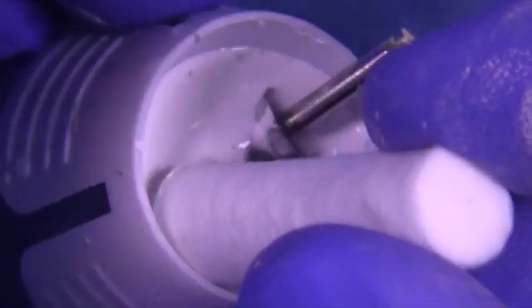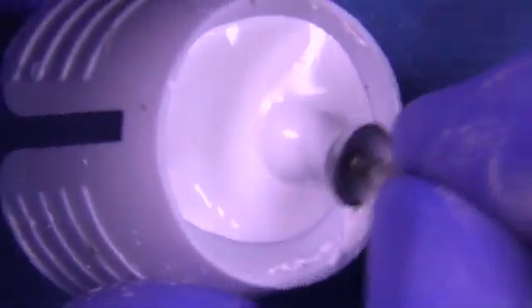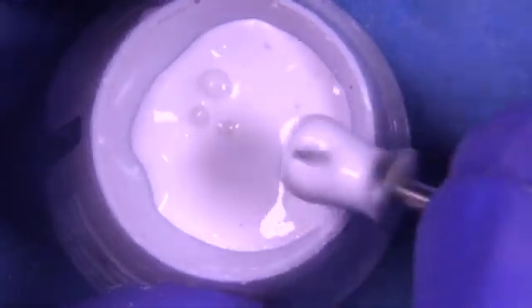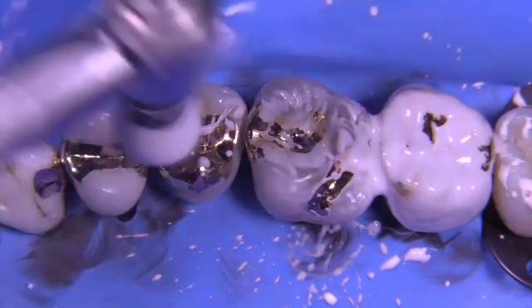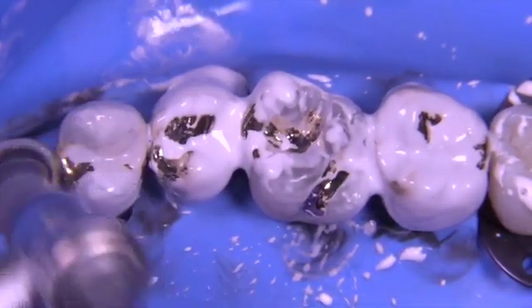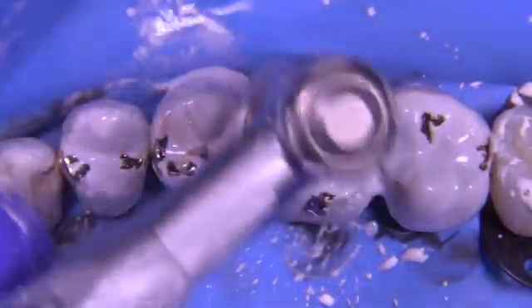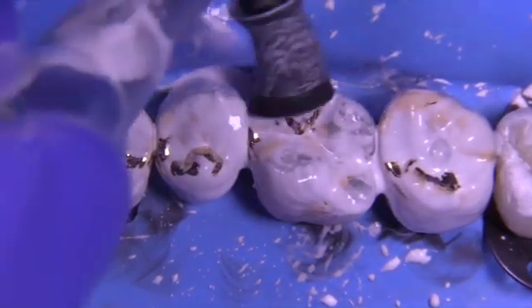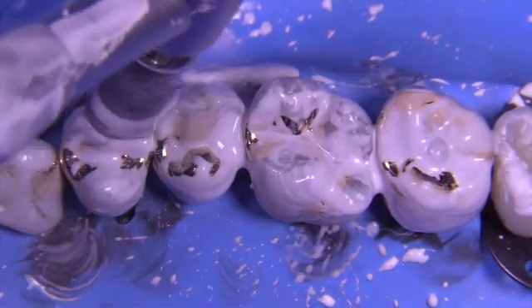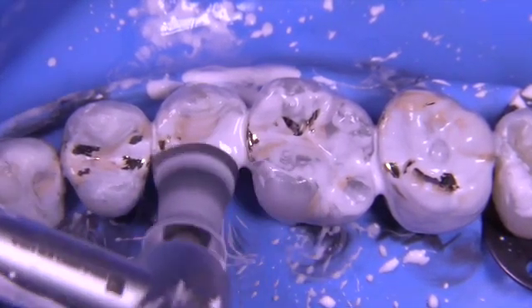Now we use one-micron aluminum oxide. Many people use this dry; some use it with alcohol. I've found the slurry works really well for the initial phase of polishing. At the very end for maximum luster I'll go dry so I can suction off the powder while polishing to keep the area clean. You can see the castings are so shiny that the surface tension is actually pushing the polishing material away — it really is amazing. Wouldn't you want restorations this smooth in your own mouth? I would prefer this material over anything on the planet in my own mouth, and a lot of my patients feel the same way.